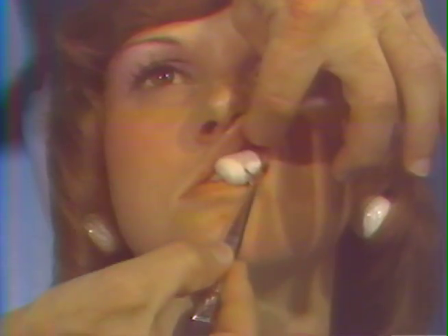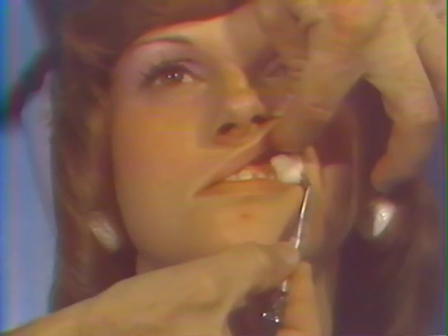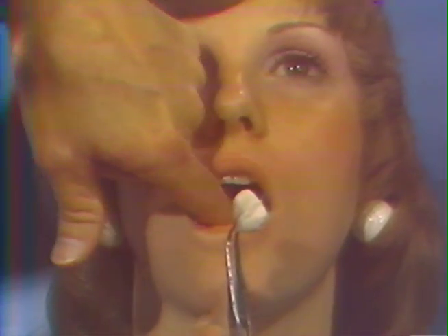At times it will be advantageous to do a horizontal type of injection with the local anesthetic needle, and you will find it advantageous to place the cotton roll on the opposite side that you wish to infiltrate. If you wish to infiltrate the left side of the tissue here, place the cotton roll in this manner. Now open your mouth, relax your lip and cheek.